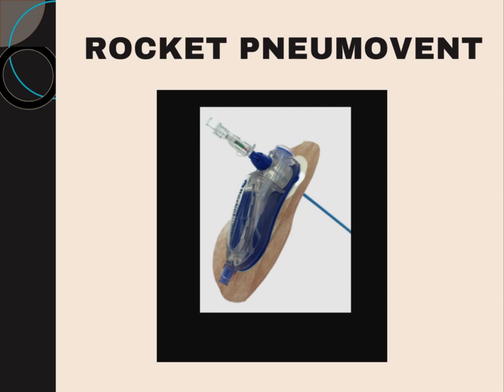Initially, we used to go for the flutter bags and all this for ambulatory cure of pneumothorax. But it is just a simple step, inserting over here, attaching this with the skin, and then they are free to go, because with this one-way valve, definitely the patient will have air leak outside the lung, and there will be less building up or worsening of pneumothorax.